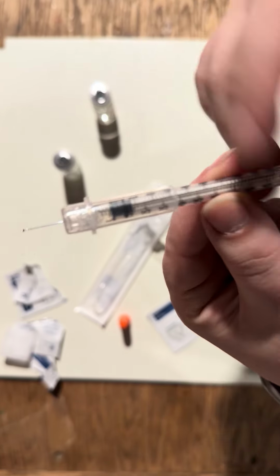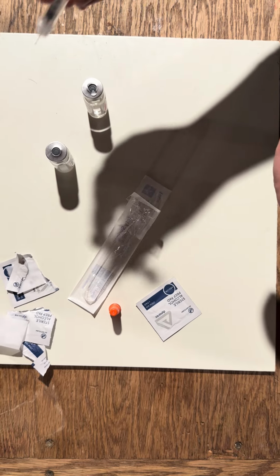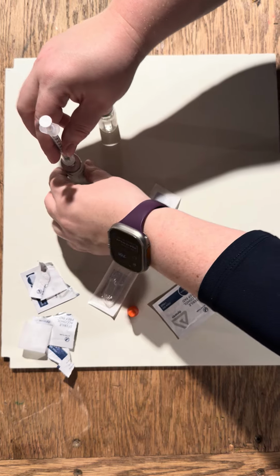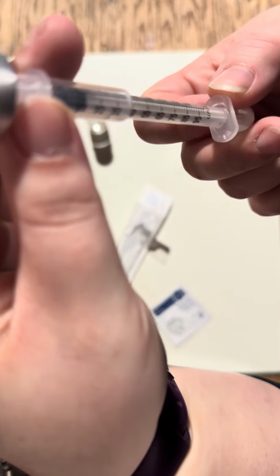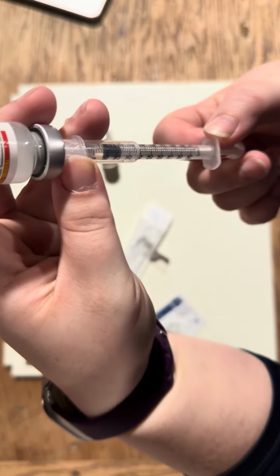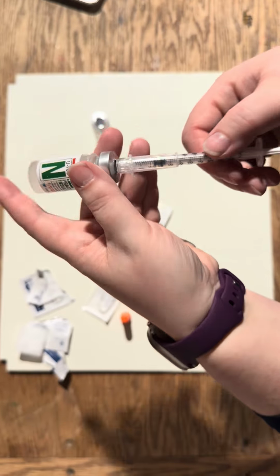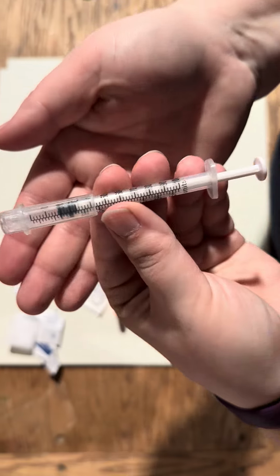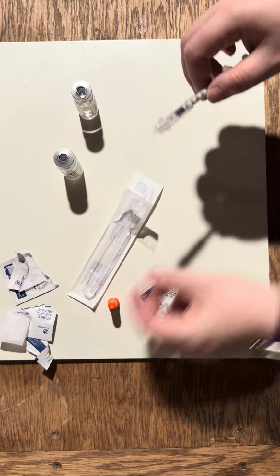I have 6 units. And now I go into my NPH, flip, and I will draw back to 18. And now I have 18 units of insulin.